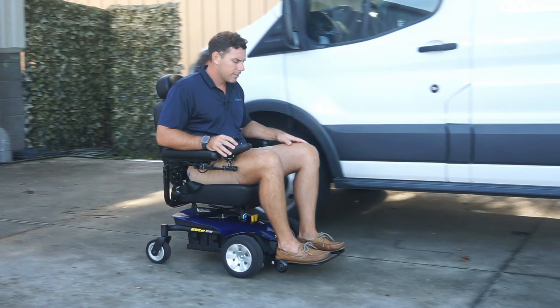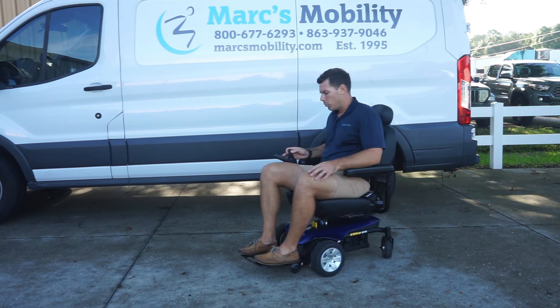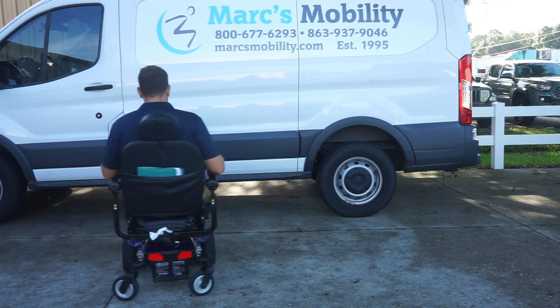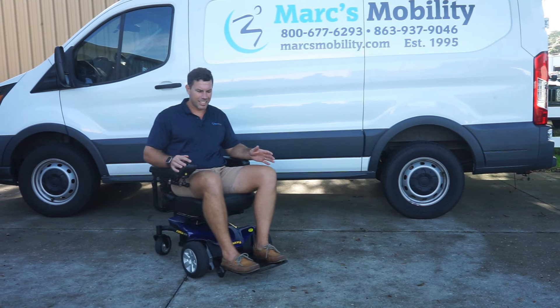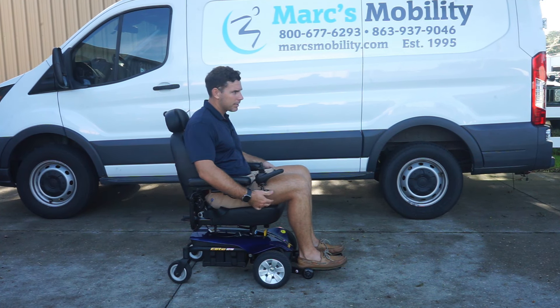This is the Jazzy Elite ES by Pride Mobility. As I said, it's a 300-pound weight capacity. You can see the really nice turning radius. I'm 6 feet tall and 220 pounds — you can see how I fit really well in this unit, how it is nice and compact.